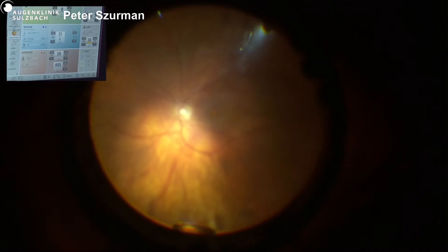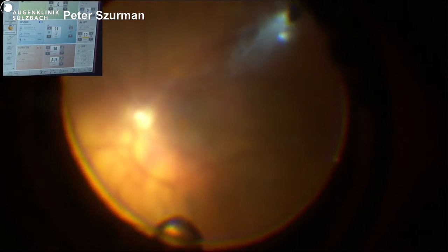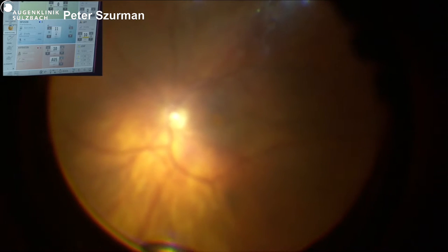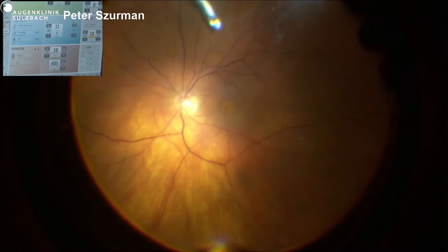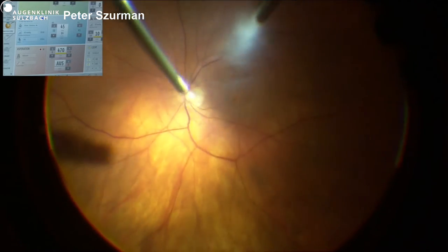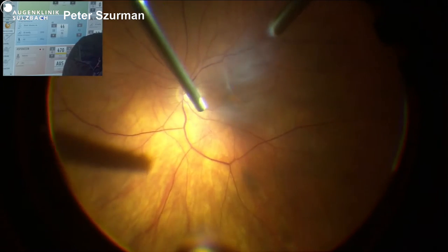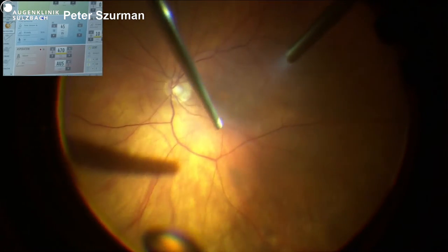Interesting. Do you change your IOL, Klaus, when you are doing combined phaco vitrectomy? For 10 years, I use what we call the Tassignon lens or the bag-in-the-lens. We use it always because we like the stabilization. It cannot move when you have an intraocular tamponade either by silicone oil or by gas.